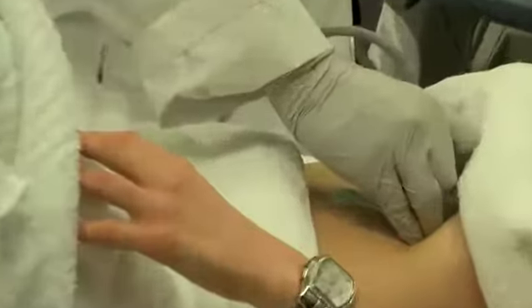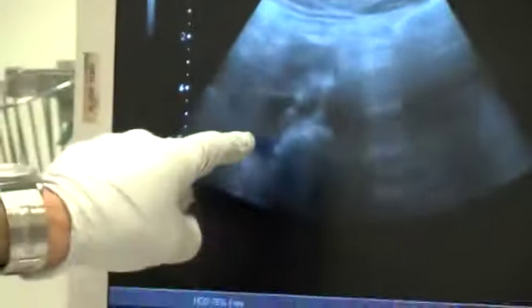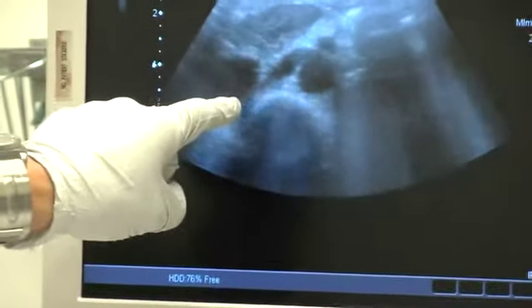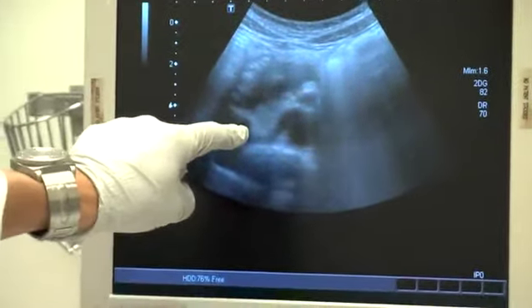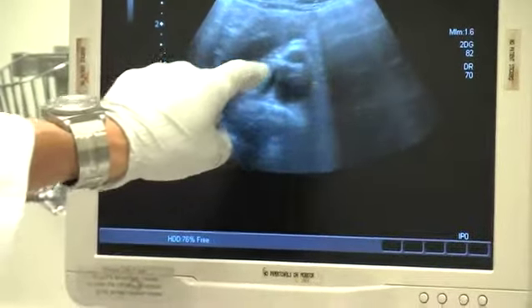And now we see several structures that are coming off of this. The first that we see that is just above the aorta, just go ahead and relax your belly there just a little bit. Coming off of the IVC, this structure right over here going from the patient's right to the patient's left kidney is the left renal vein.